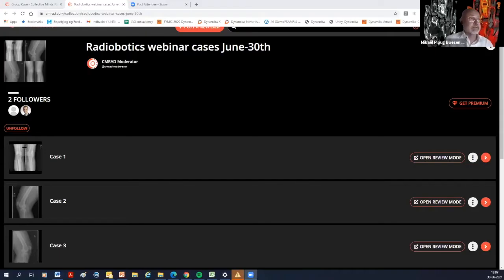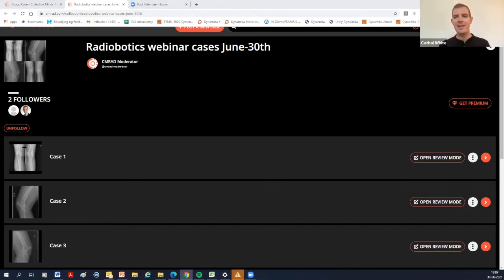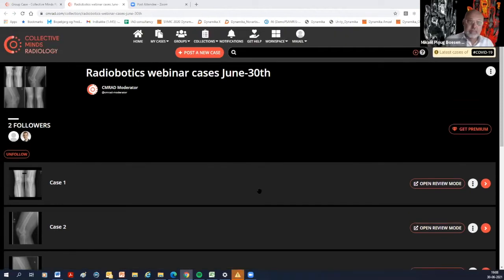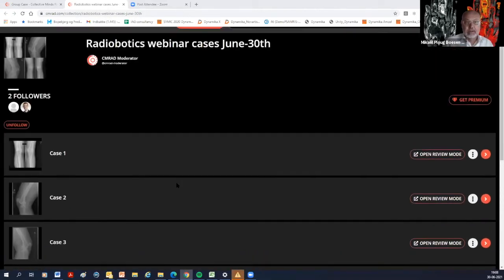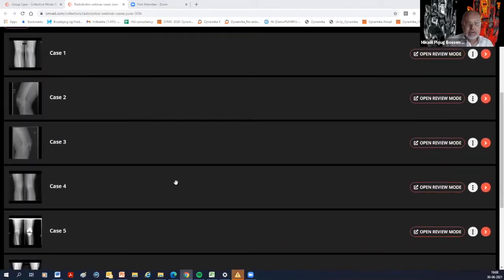I'd like to share my screen and go through some of the cases. We're on the landing page of the Collective Minds platform and we have six cases. We may not go through all of them, but after this meeting you'll be able to assess them and interact with them yourself. We want to keep this webinar as interactive as possible, so please ask questions in the chat.